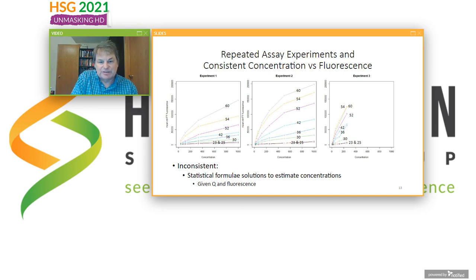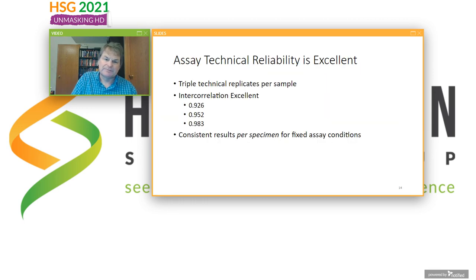So, for example, if I fit a calibration equation based on experiment 1, it actually would not work very well on experiment 2, experiment 3, etc. And so there lies a practical problem with all of this. So what's the source of this variability? What do we need to do about it?